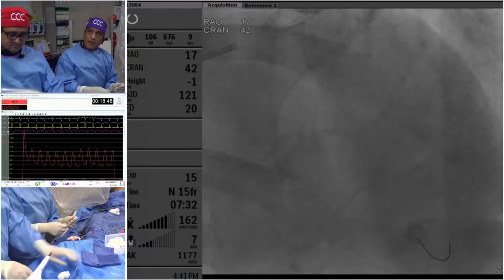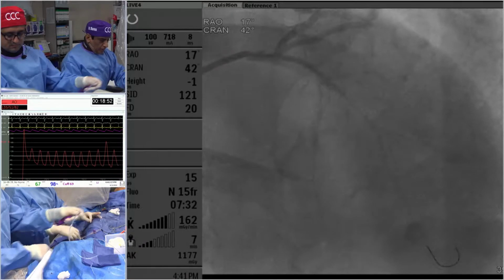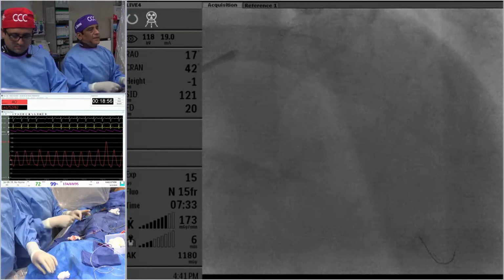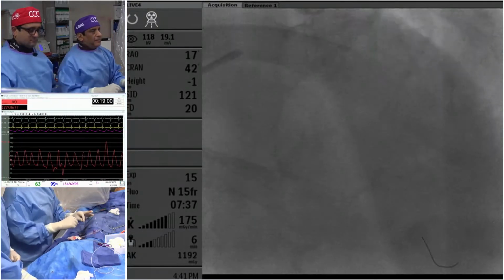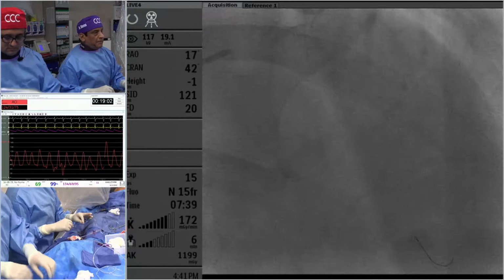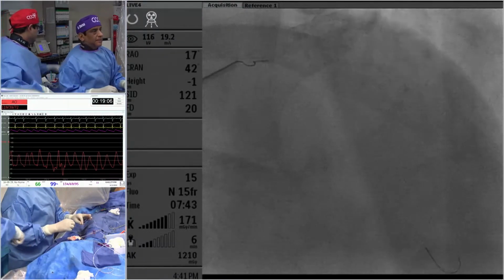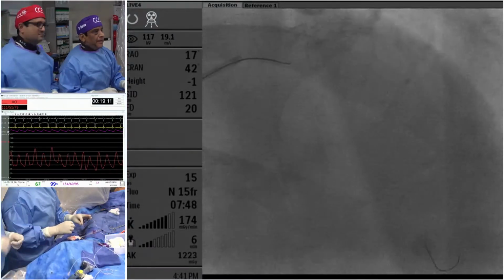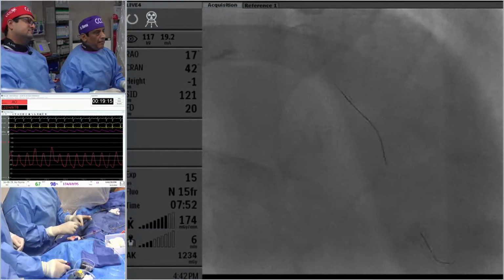And actually the good case, which is getting ready, is the CTO in room 2. As soon as they're ready, here is a very simple case. We are going to just do a balloon dilatation, and in the area which does not get very good expansion, we'll put a stent, and then we do the IVUS. Because the idea there is, and of course, look into this, the healed left main ulcerated dissection.